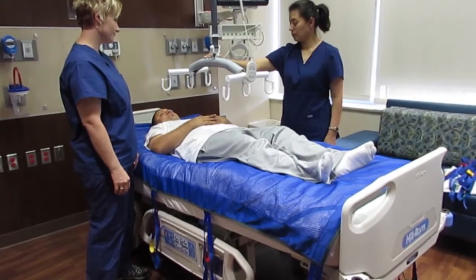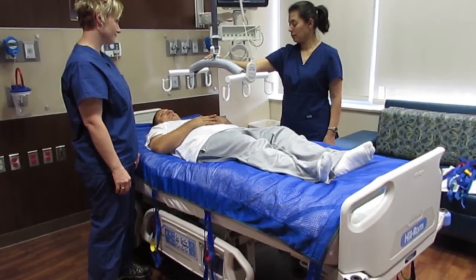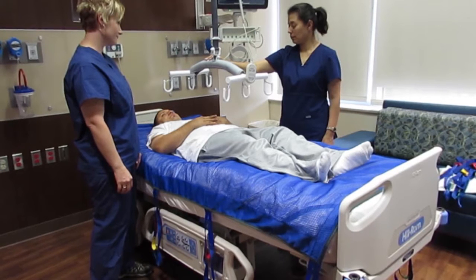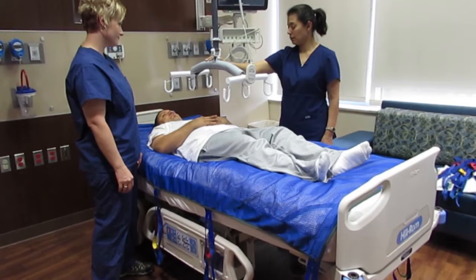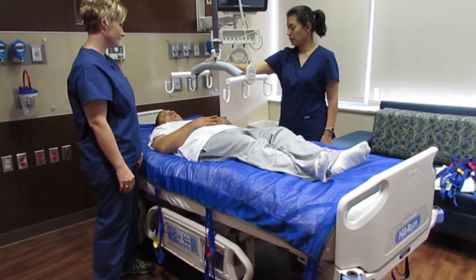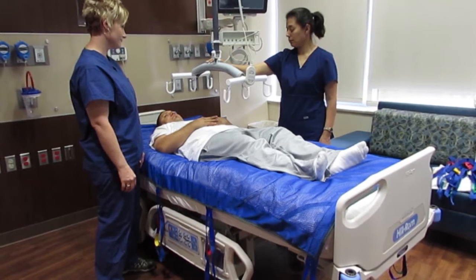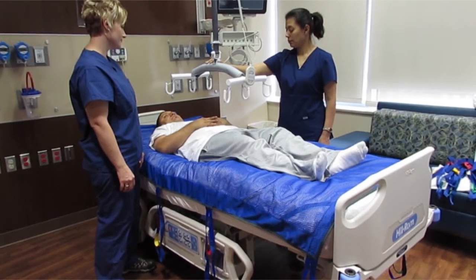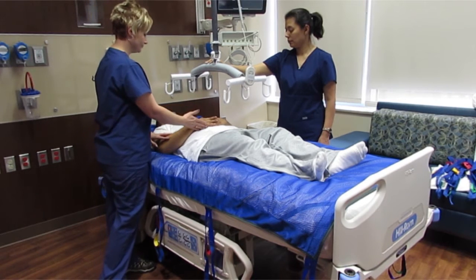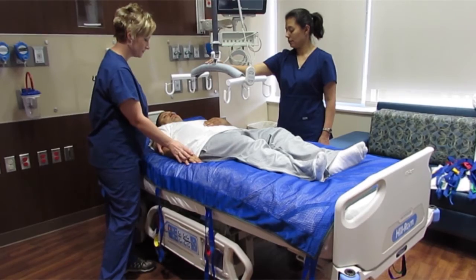Place the repositioning sling by log rolling the patient, being careful that the straps of the sling do not rub against the patient. The repositioning sling can be used with a Tolos ceiling lift or mobile lift. Place the spreader bar over the patient's torso perpendicular to the patient's shoulders, and be sure the patient's arms are placed across their chest instead of on their side.